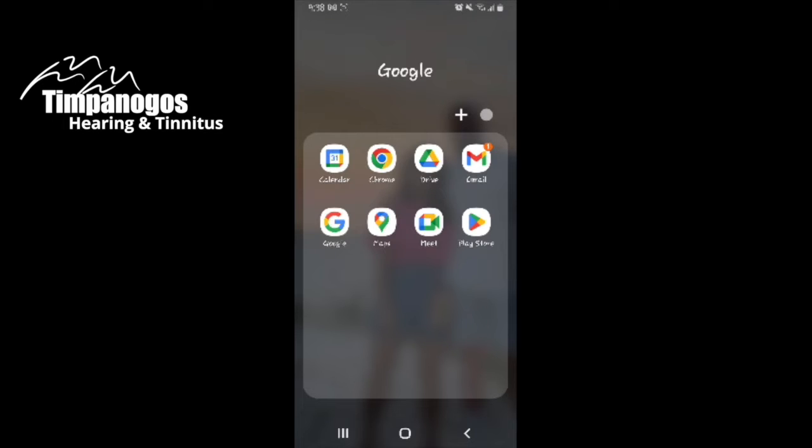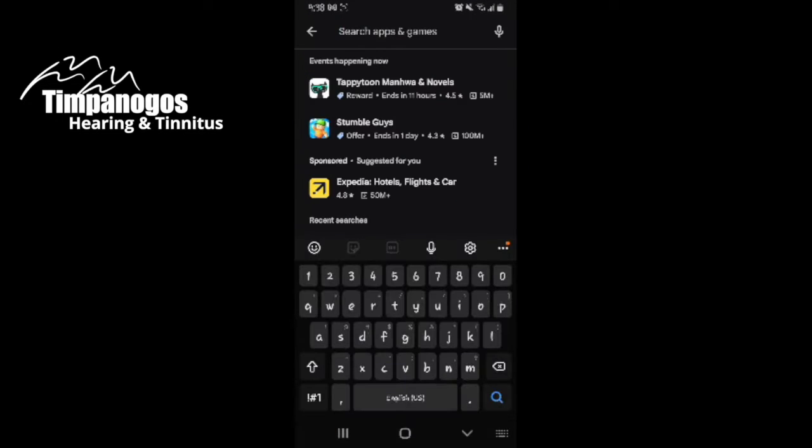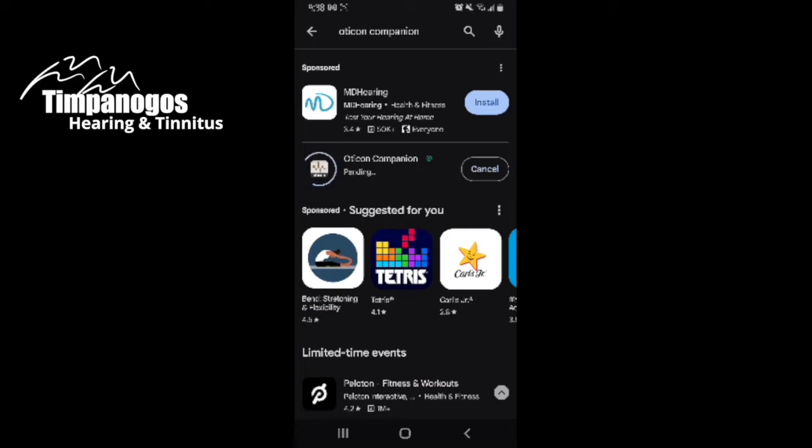The first thing you're going to do is go to your Google Play Store. We're going to go ahead and search for the app — it's Oticon Companion. It is a free app, so we're going to get that installed and it's going to start downloading.